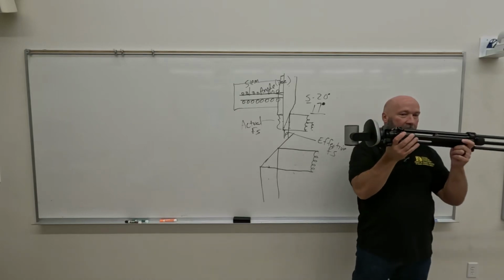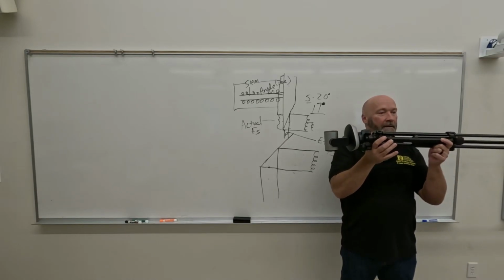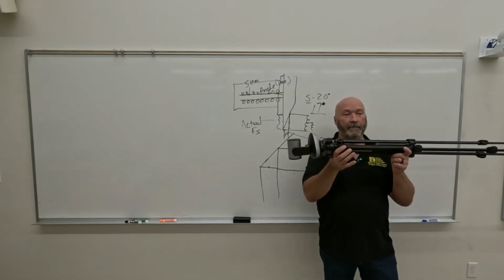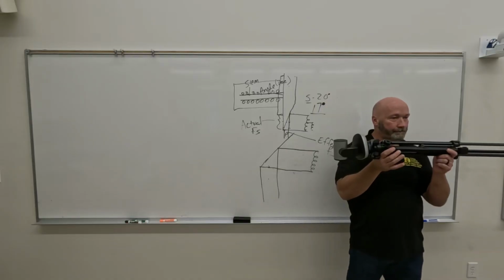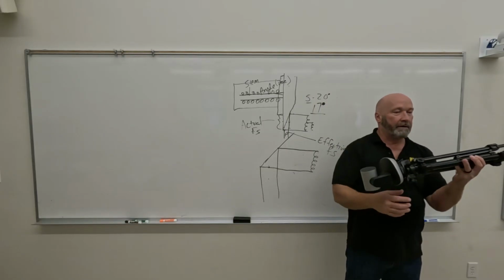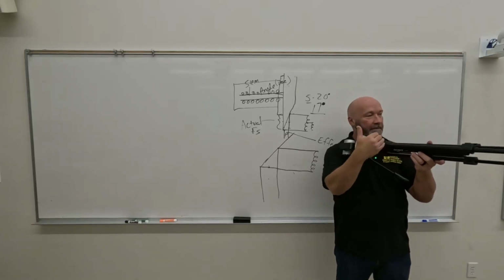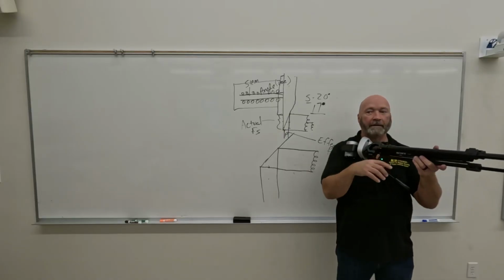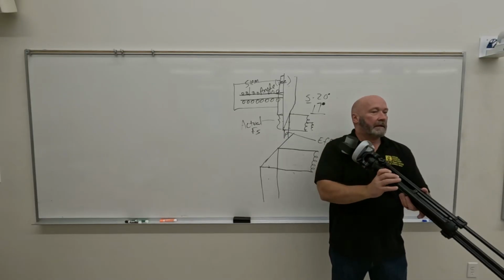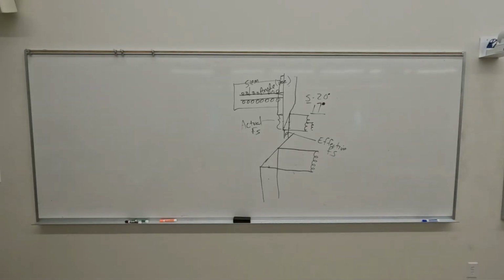We use a larger area of bombardment, right? What would be the significance of a large area of bombardment? Heat dispersion. Yeah, we can spread the heat out on a bigger area, but we get the benefit of the smaller projected focal spot to give us increased sharpness, recorded detail. That's what we refer to as the line focus principle.